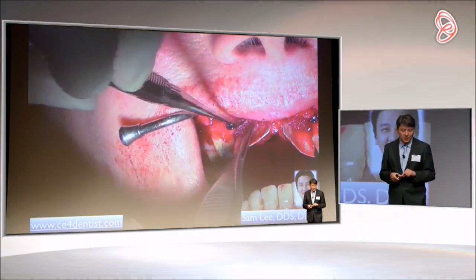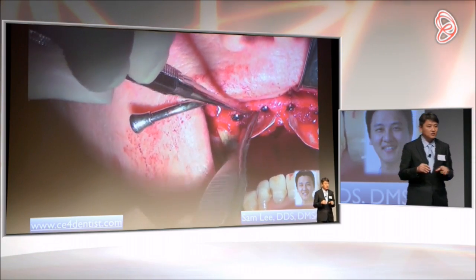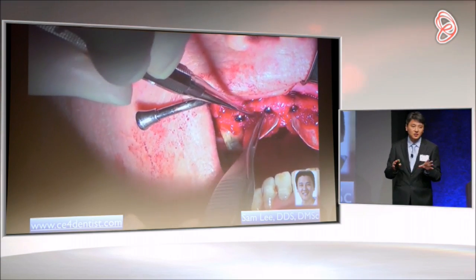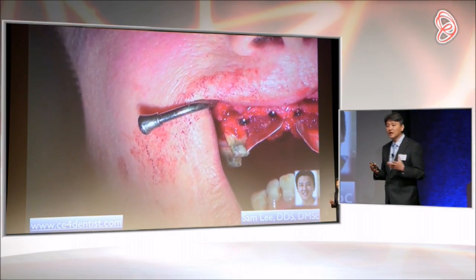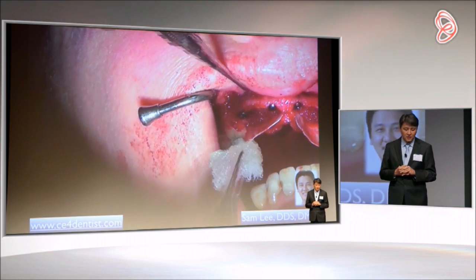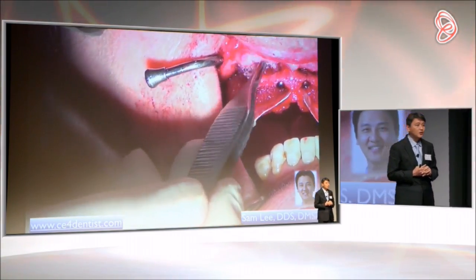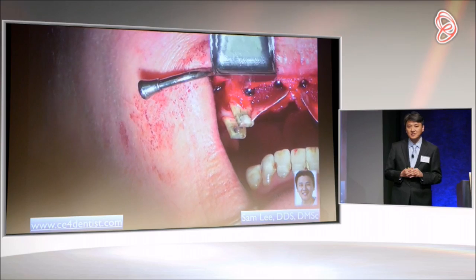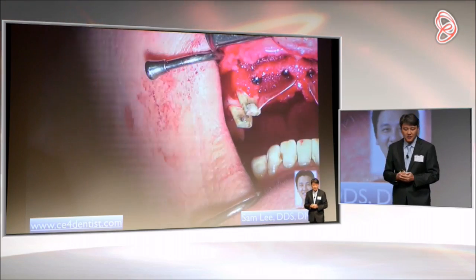Therefore, implant surgery and bone graft can be done at the same time. All you have to do is really take care not to have any dead space, and I try to remove any wrinkles in the bone block, and I try to position my spongy bone in the correct location. So especially for palatal defect, this spongy bone is very beneficial. On the facial, it's held by the sutures. As you can see, we have more than 90% of our dental fixtures naked in the bone, and by utilizing spongy bone, we are building bone at the same time as implant placement.